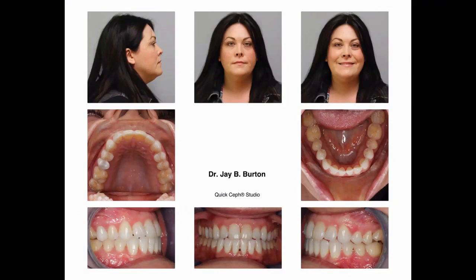This is kind of a straightforward case. When it comes into your practice, you're thinking, man, I don't even need a Ceph. Do I really even need a pan? And in some of the Facebook groups I'm a part of, I see a lot of discussion about, oh, do we even need a Ceph for this case? Oh, do we even need a pan? Well, in this case, I already had a pan. What would be the benefit of taking additional records on this case?